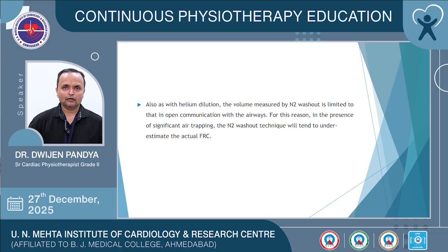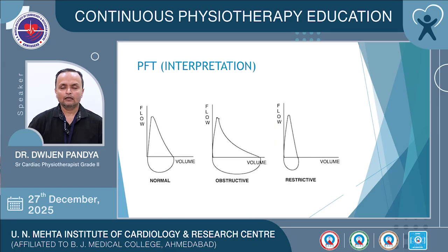Same as with helium dilution, the volume measured by nitrogen washout is limited to that in open communication with the airways. For this reason, in the presence of significant air trapping, the nitrogen washout technique will tend to underestimate the actual FRC.